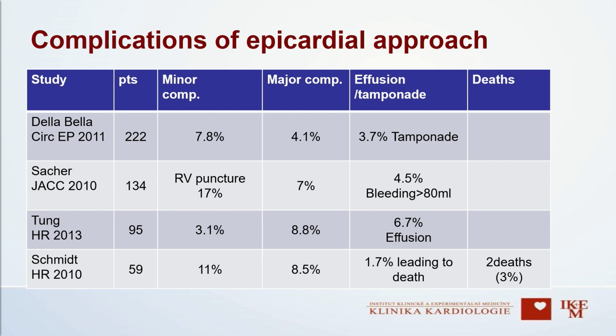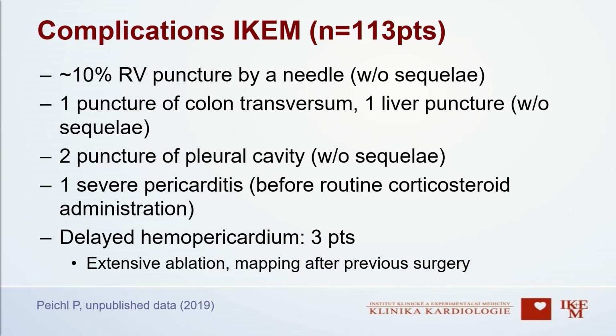Today, as you know, there is an approach with the insufflation of CO2, and there are some observational studies, very small series so far published. It looks like you can avoid perforation, but there is bleeding again in some of these series, about 4% of serious bleeding. So nothing is absolutely safe, but you have to be probably cautious.